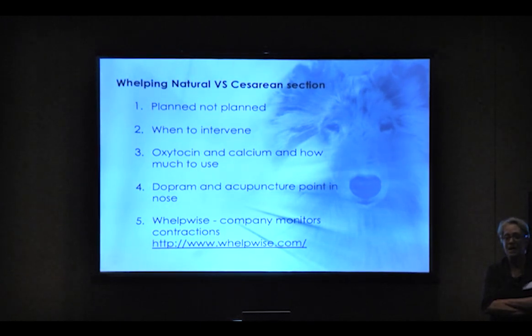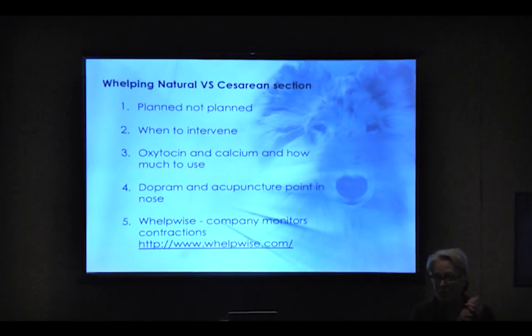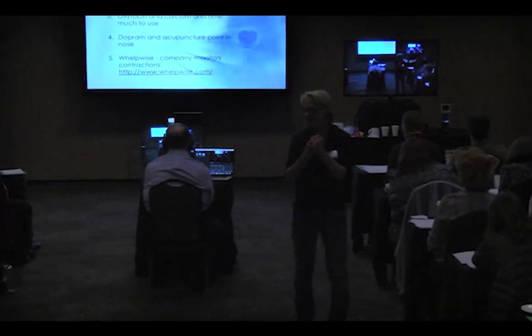It also monitors the heartbeats, so you know what the heartbeats of your babies are, and you know if you're getting into fetal distress. Remember I told you under 150? If those babies are under 150, they're in distress. WhelpWise will actually tell you. It's a little monitor, like a little Doppler that they put on the stomach, and you just put it on your telephone and send it to them. They're there 24/7 for you.